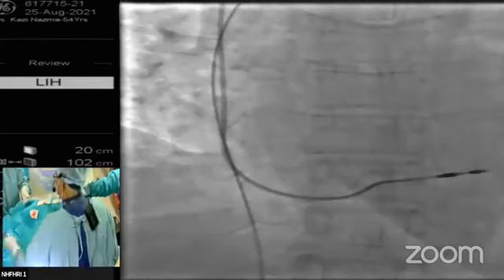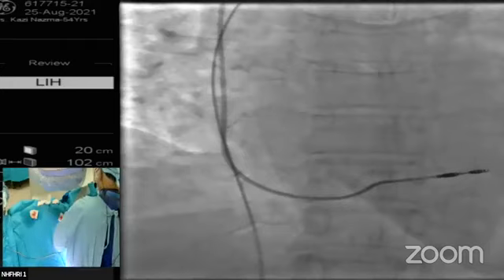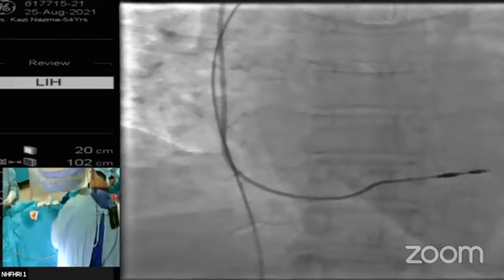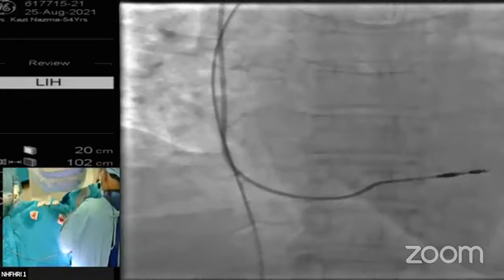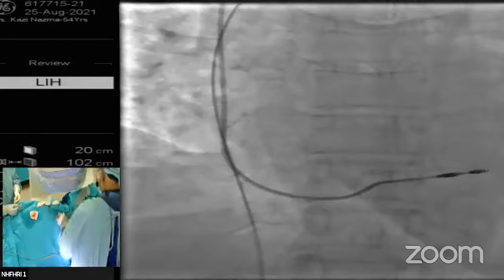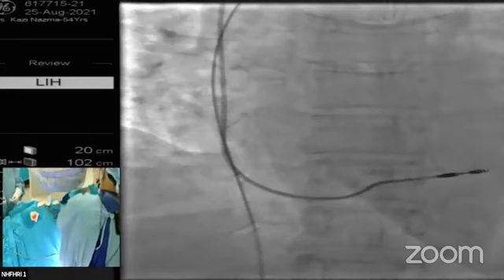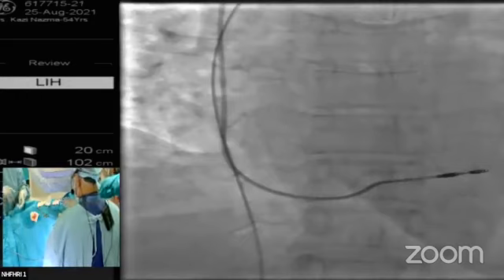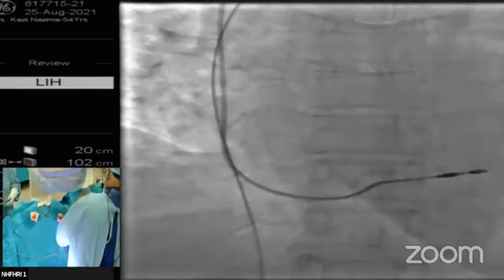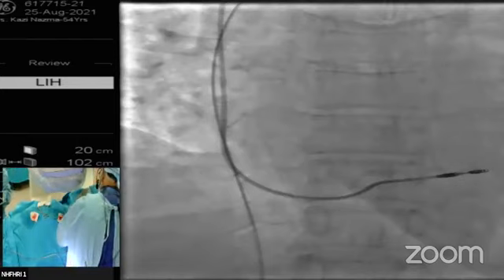In the examination they ask what happens if impedance decreases. And from the ECG, how will you confirm that the lead is in the mid septum? Now, fixation of the lead to the underlying muscle with silk, not with catgut or other absorbable materials, because it should be non-absorbable. You can also use Prolene. So I am fixing the lead with the underlying muscle in the pocket.